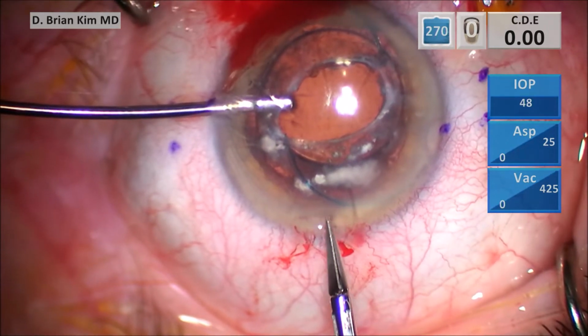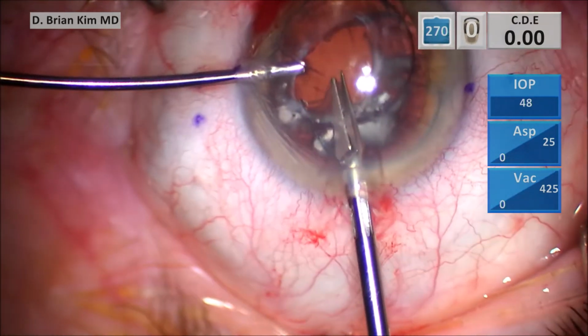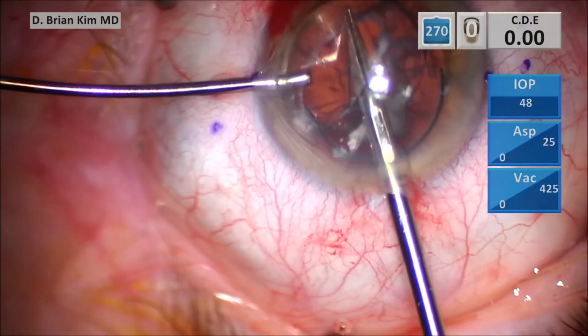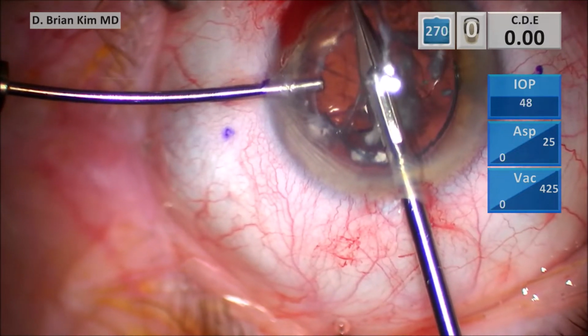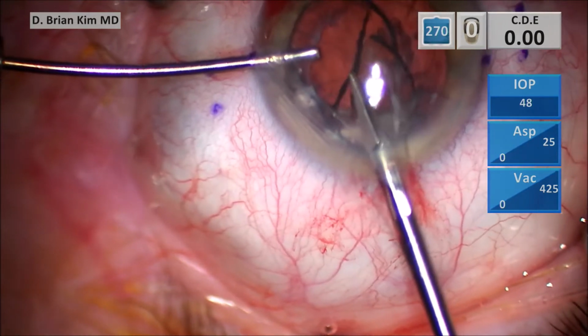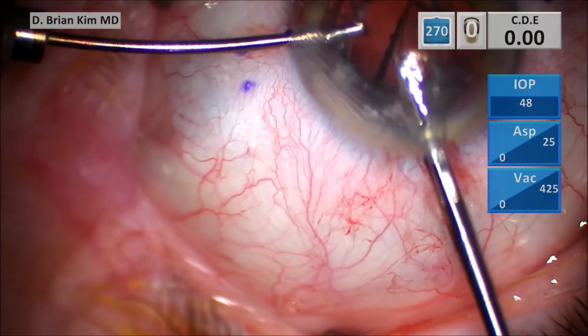You can see I have the teeth closed first, wiggle it in. And then as I cut, I have the teeth a little bit sideways. I'm cutting the optic only. You can see this is a 3-piece lens. Very carefully, I'm cutting the lens in half. I'm trying to pull the scissor out. It's getting caught on some of that capsule material.